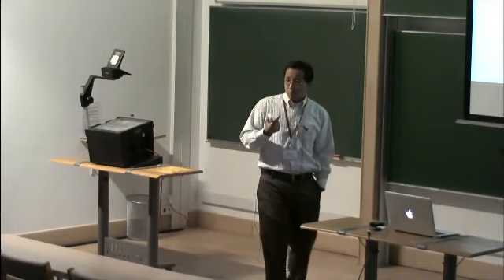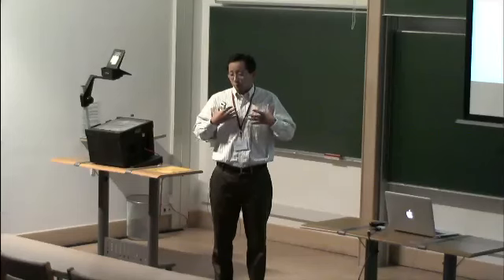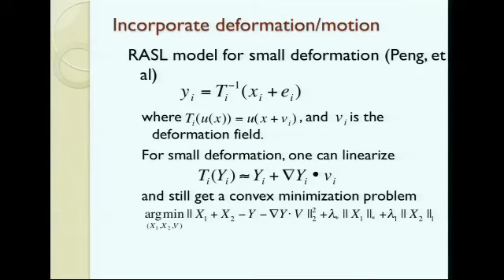Your body is not stationary. You breathe, especially for lung, it's breathing, it's moving. So there is no strictly stationary part. But on the other hand, after some deformation, one image can be registered to the other. So the main thing is, can you also try to find some appropriate deformation or registration, so that after that registration or deformation, the low rank is more valid?